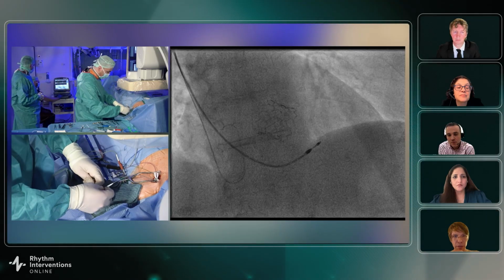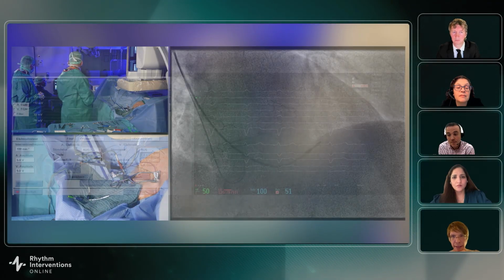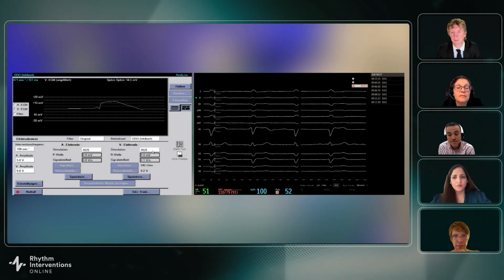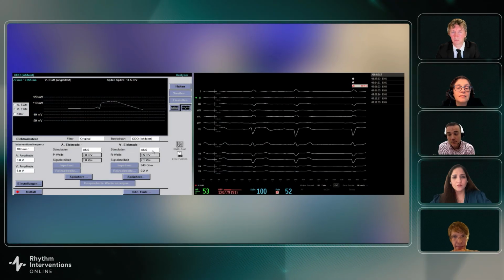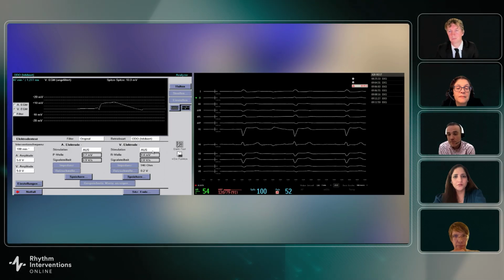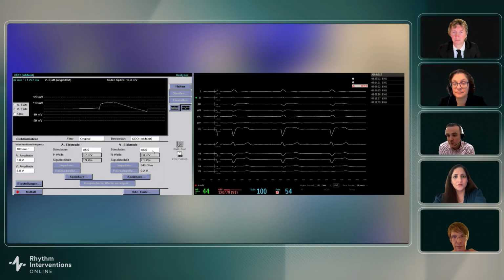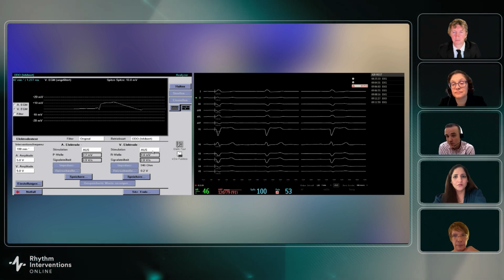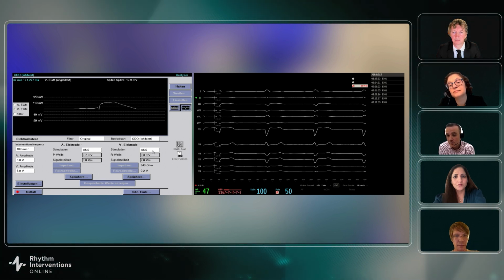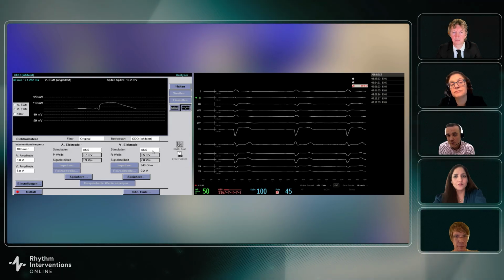Just one quick question: you don't retract the helix while slitting the catheter? You leave it as it is? Usually, yes, the stylet. Yes, I start as it is. I know that many people do like that. For me, I will slit the catheter, and after that, I will control the position of my lead. It was really important for me to look at the ECG at the end, to look at the morphology and all measurements. And here we can see the native ECG, and then I will paste.